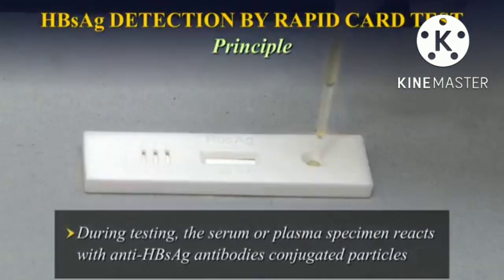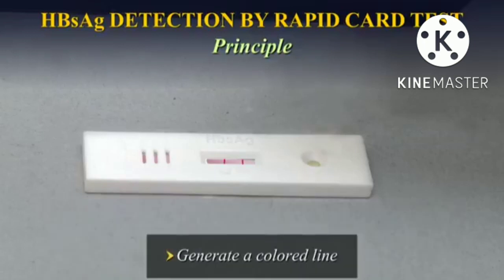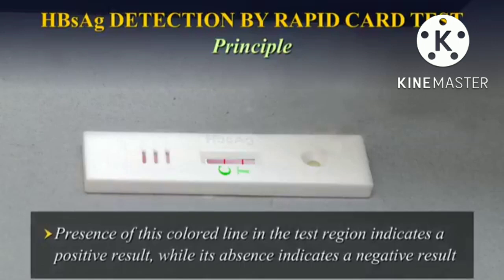During testing, the serum or plasma specimen reacts with anti-HBsAg antibodies conjugated particles. The mixture migrates upwards on the membrane chromatographically by capillary action to react with anti-HBsAg antibodies on the membrane and generate a colored line. The presence of this colored line in the test region indicates a positive result, while its absence indicates a negative result.